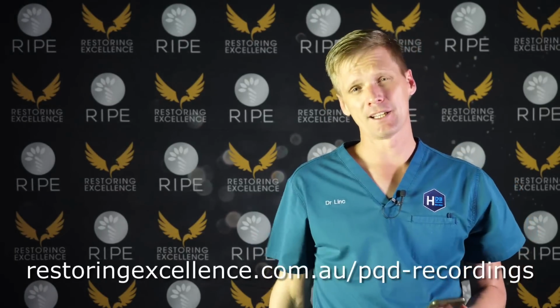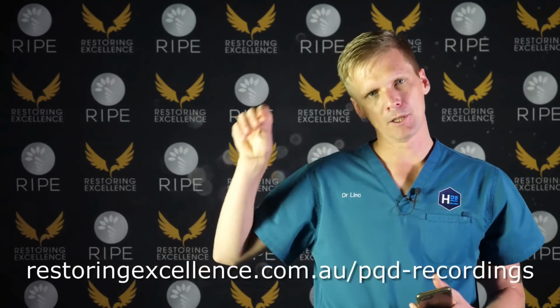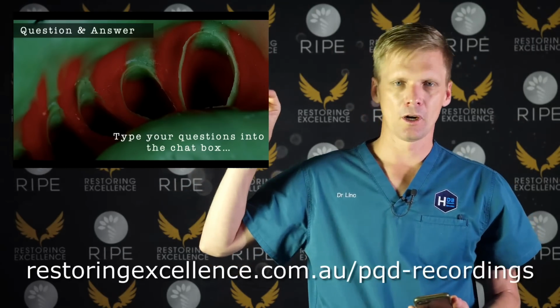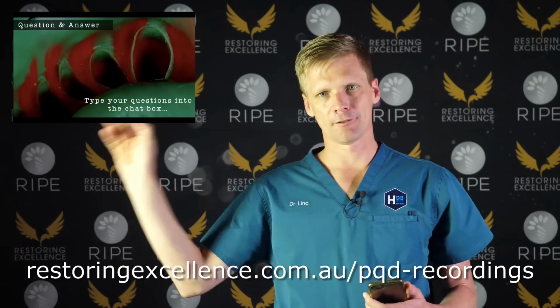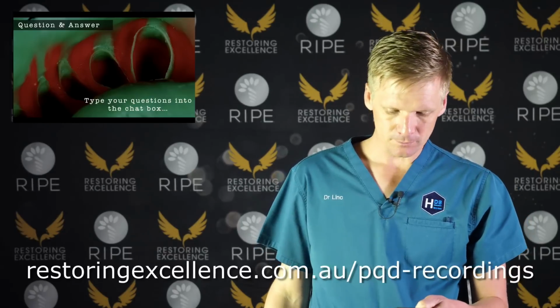Now the main reason you get drags is because the teeth are not dry. So mostly when you get drags up near the back, it's because either you got a trapped air bubble or, most likely, there's a bit of saliva on the tooth, and as you put the impression in, it pushed the saliva off the teeth. So that's why you get drags most of the time.